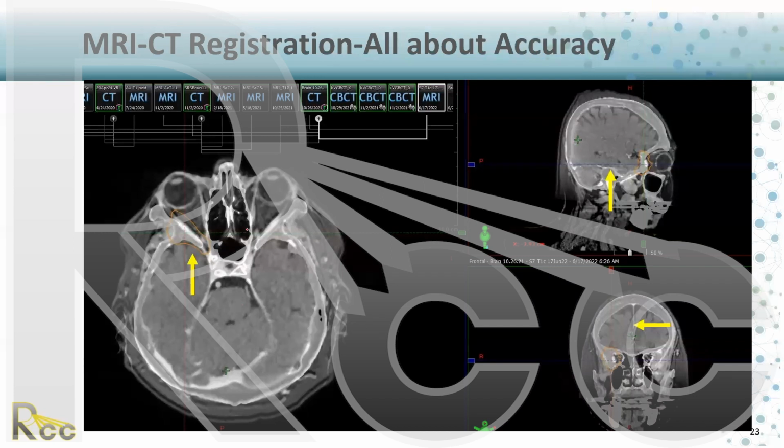Thank you so much. Here's the multi-modality MRI. You can see MRI-CT, CBCT registration. And again, check the feature points you can grab. It's not only one feature point, depending on site. Here is the curvature of the bone, like this bone.